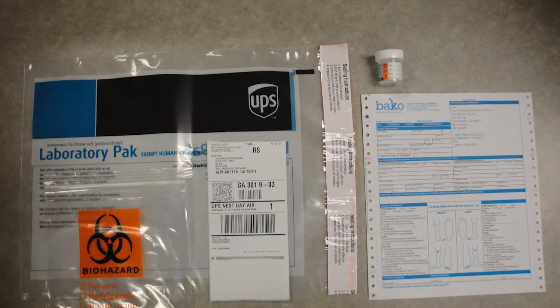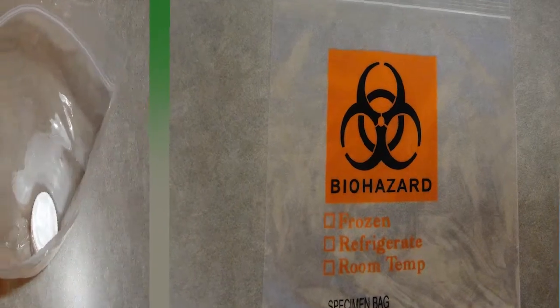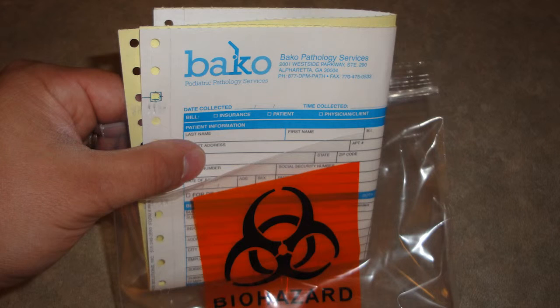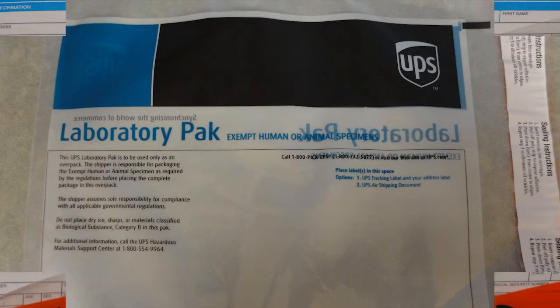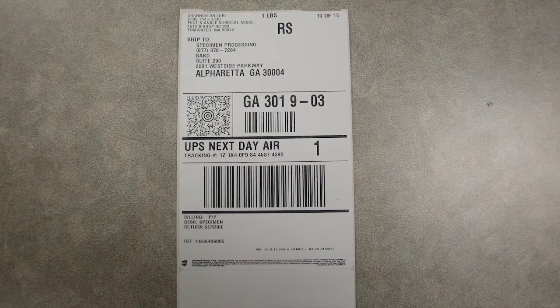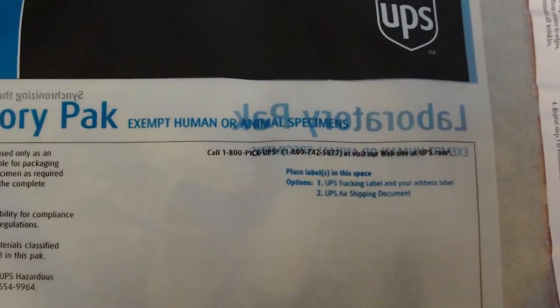The specimen, demographic sheet, and pathology orders will then need to be added together in a biohazard bag. Put the specimen in the Ziploc portion and the demographic and pathology orders in the front pouch. You will then need a UPS laboratory pack and shipping label, which are located in the nurse's station with all the pathology supplies. The pre-printed shipping label is to be placed on the front of the laboratory pack in the spot that states "Place this label here."